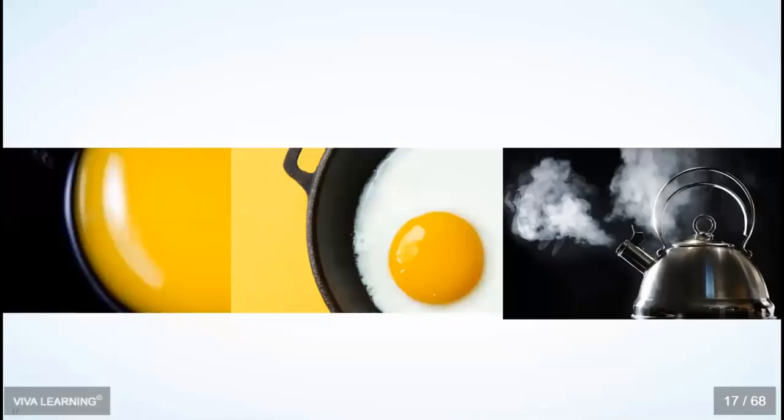It's important to understand the difference of what saturated steam is. If you think about this teapot, you see the end of the spout of the tea kettle, and then there looks to be an empty space, and then you begin to see the billowy, steamy cloud after that. The saturated steam is not the billowy, steamy cloud. That's where the air has hit it, and it's allowed the molecules to move further apart, and so they're going back into their water state.